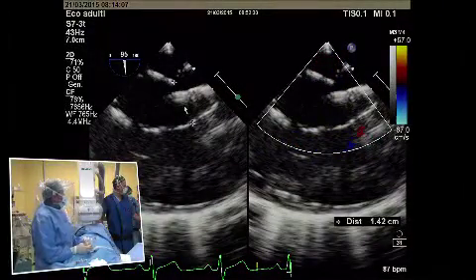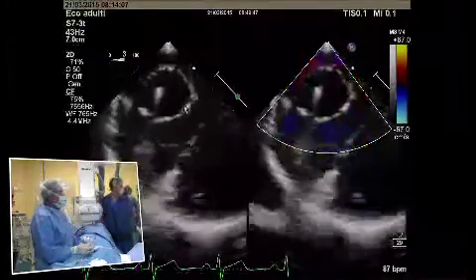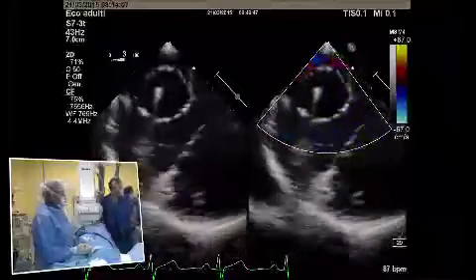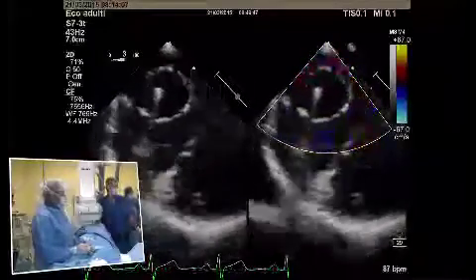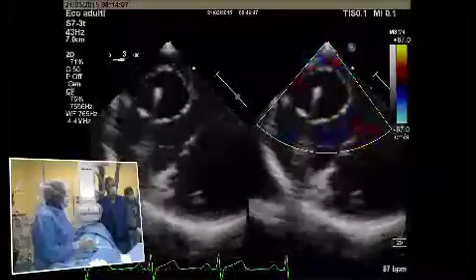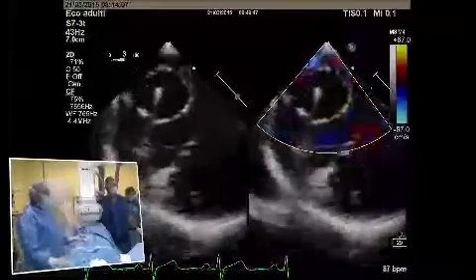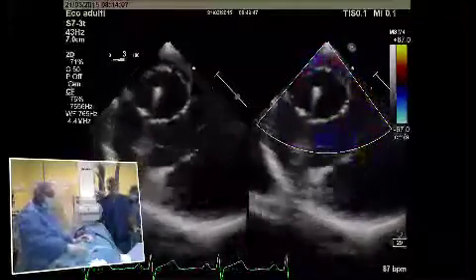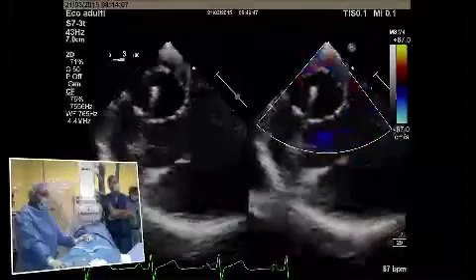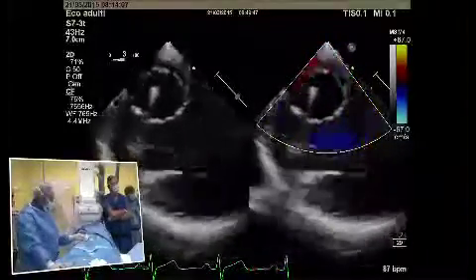Yeah, Aki, going back to the Ellison question, as expected, the measurements taken by echo are almost the same as the balloon sizing, so around 15, 16 millimeters. So I agree with you that in this case, balloon sizing is not really mandatory. Did you have a particular device you had in mind here?